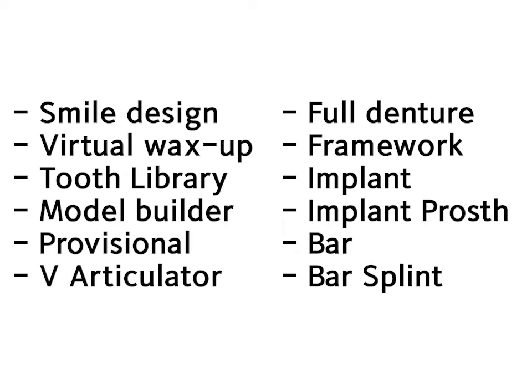This type of module allows clinicians to diagnose and plan treatments with dental implants. The software can be used to combine radiological information with intraoral examinations by merging DICOM files from a CBCT with 3D files generated by intraoral and extraoral scanners. With these modules, we can design a surgical splint for guided surgical procedures and provisional restorations with different implant systems, depending on the libraries available in the software.